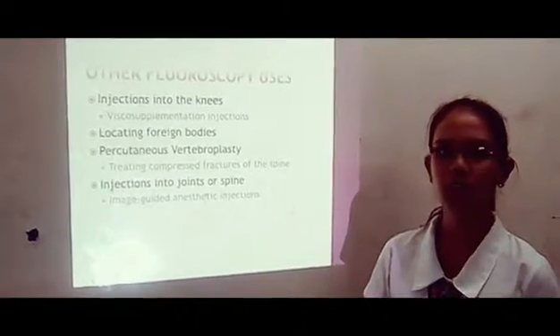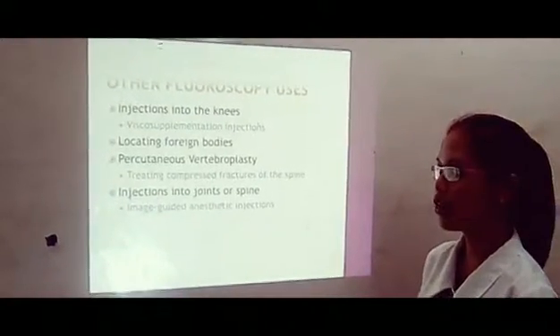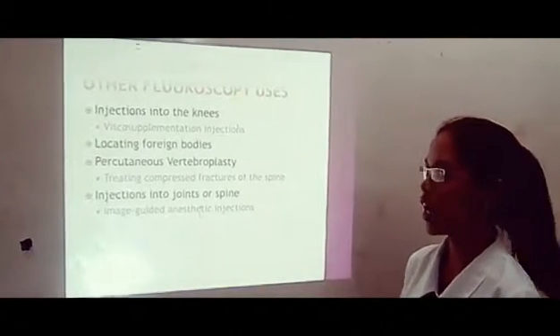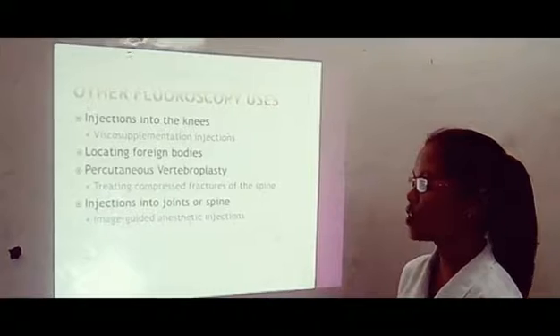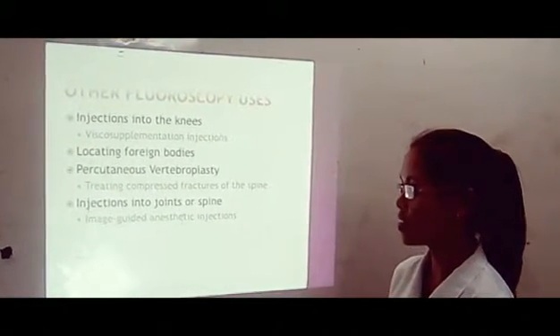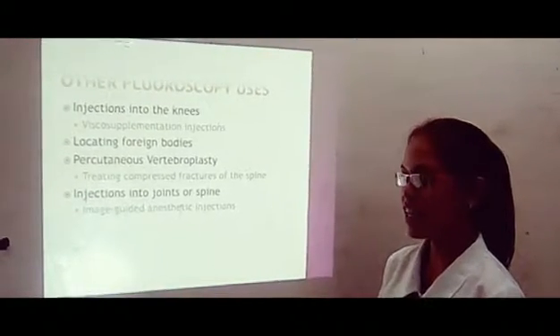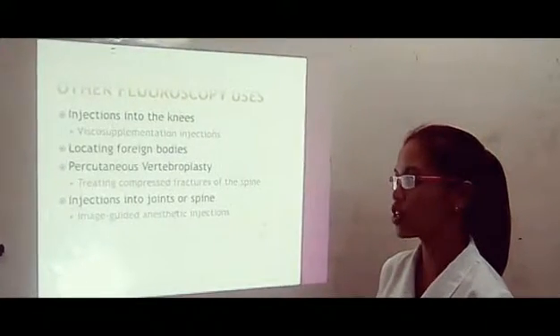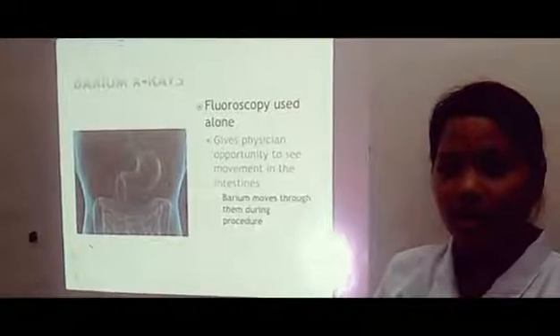Other fluoroscopy uses. Injections into the knees through viscosupplementation injections. Then, locating foreign bodies and percutaneous vertebroplasty, treating compression fractures of the spine. And lastly, injections into joints or spine through image-guided anesthetic injections.